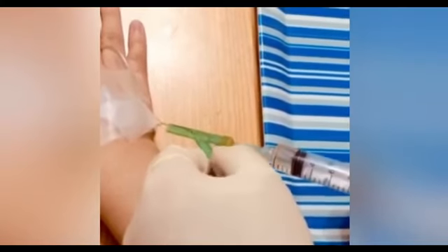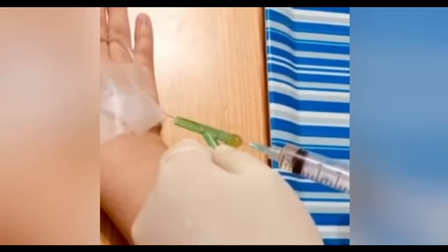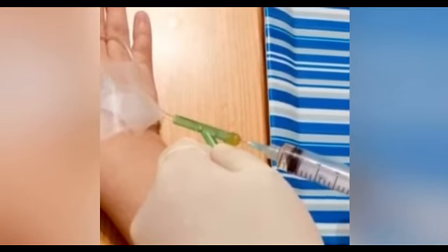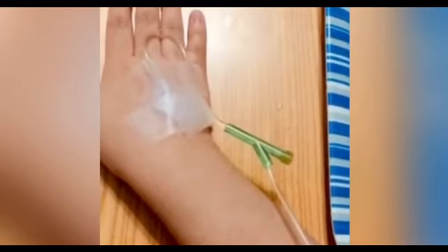We administer the medication slowly. After administering the medication, we need to flush the line again.